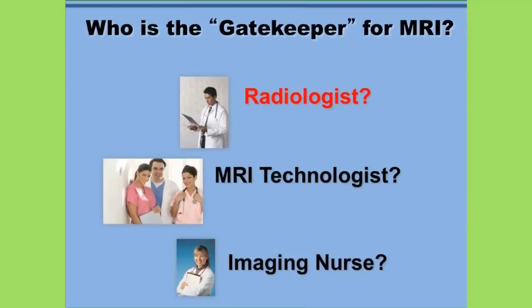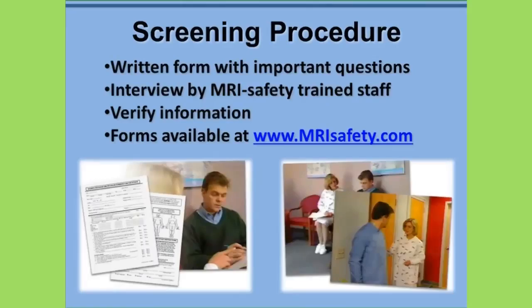Therefore, radiologists at your MRI center have an obligation to acquire the knowledge base that is necessary to ensure a safe MRI environment. As I previously mentioned, screening involves the use of a printed form to document the procedure. After the patient or individual completes the form, a verbal interview must be conducted by a healthcare professional specially trained in the field of MRI safety.